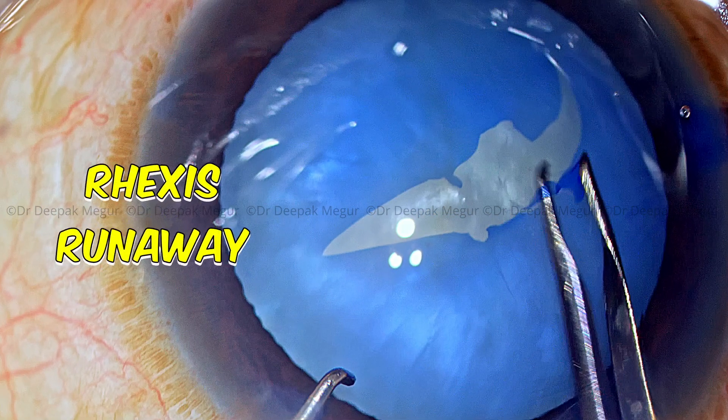I'm stabilizing the globe with my second instrument just to ensure that the eye is better controlled and I'm going in with my forceps. I puncture the anterior capsule and we can see there's no fluid coming out — I'm trying to keep the capsule flat, using a combination of tearing and shearing technique. The moment I realize I have good control I'll be folding the capsule, and the moment I realize I don't have adequate control the capsule is laid flat and pulled centripetally. At this moment the patient suddenly moves his eye and an irregular rhexis is created — thankfully we don't have any loose ends, so we don't have any high-risk torn edges which can run away peripherally.